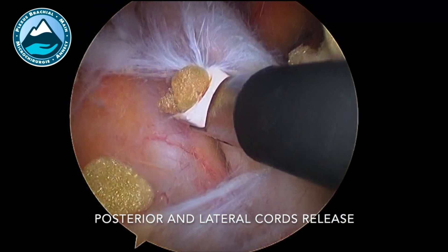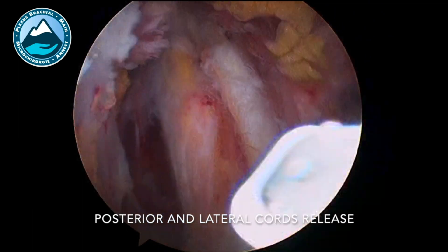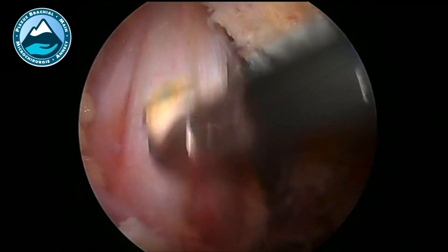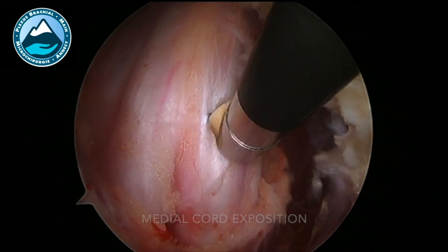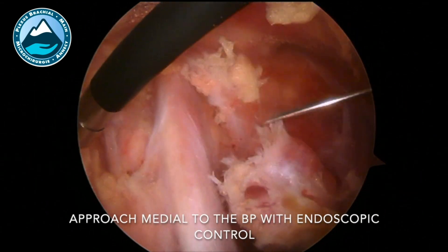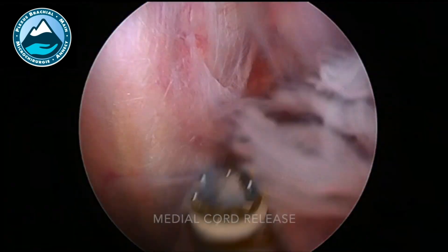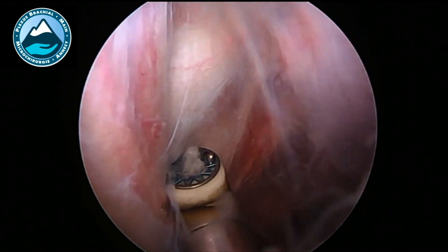From there, anteriorly from the brachial plexus, we can expose the posterior and lateral cord, release them, and then move medially and expose the medial cord. It's always possible to perform a more medial approach, almost in the way of the thorax, and have a good exposition and release of the medial cord.